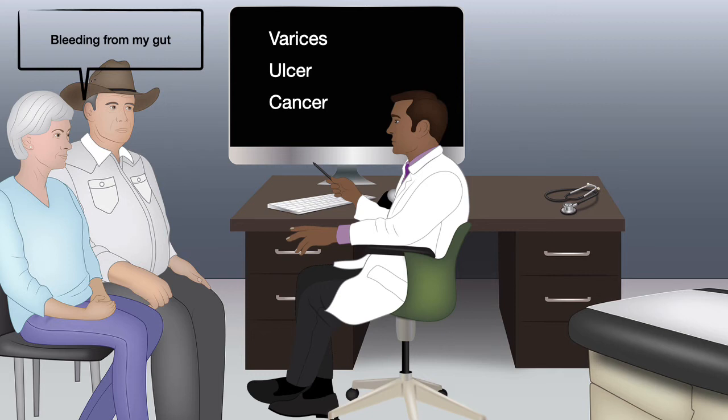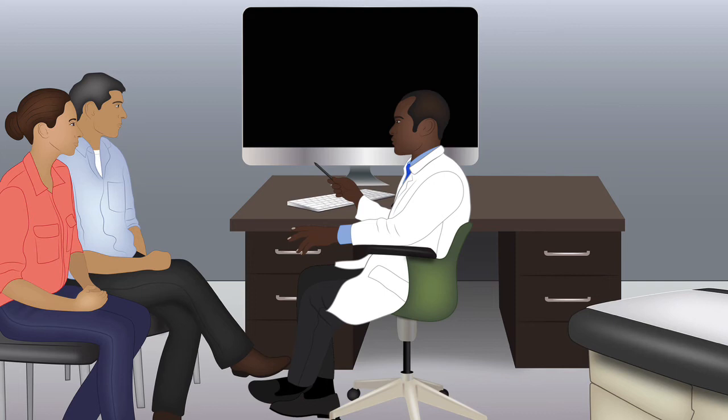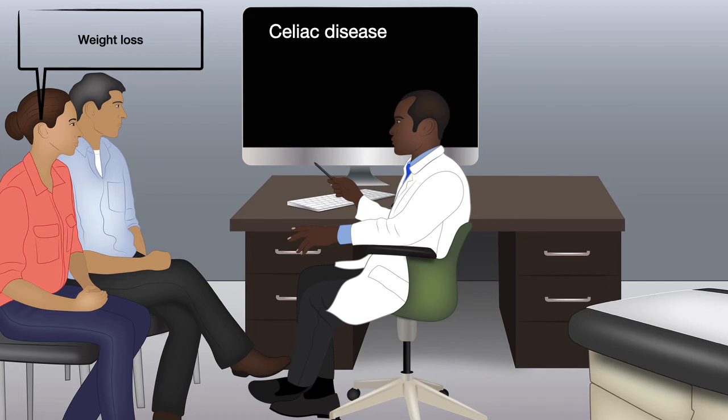All right. Next, let us look at a young lady who has come in with weight loss. And when you think about weight loss in a young person, one of the things, especially if they have diarrhea also, one should take biopsies from the duodenum to rule out celiac disease. And always with weight loss, keep in mind cancer.